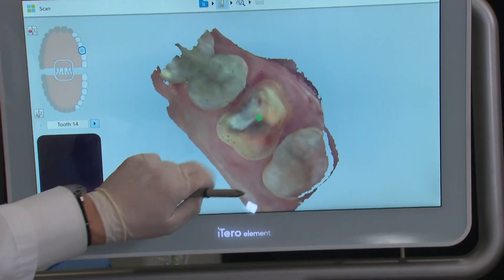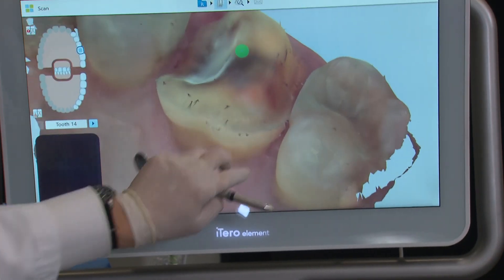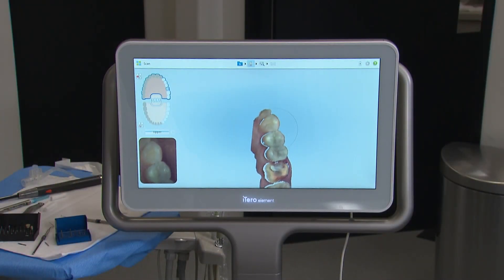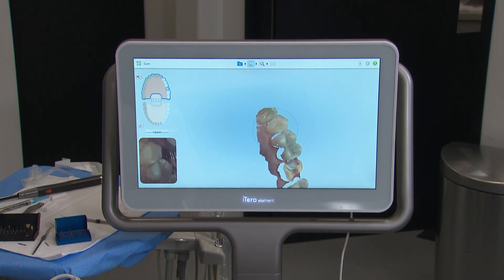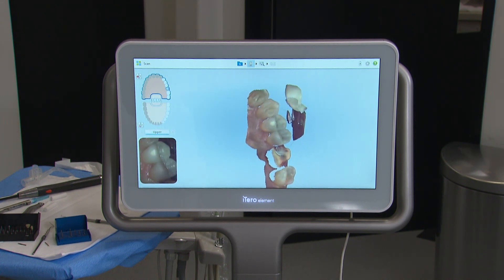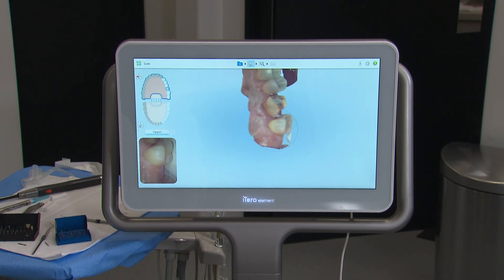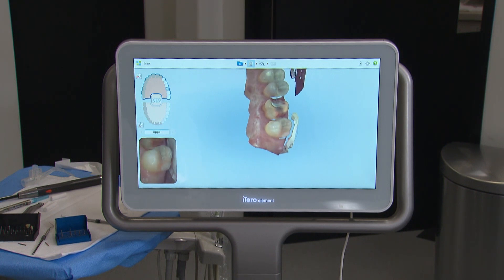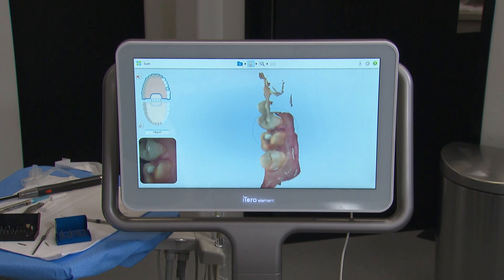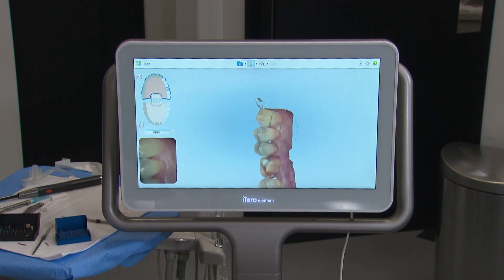As with any impression, drawing excess fluids from the teeth and gingiva will improve the accuracy of the impression. For the upper and lower quadrant scans, we start with the occlusal surfaces to lay the foundation of the digital model, then rotate the scanner and sweep along the lingual and buccal to add those surfaces and any undercut areas into the model. Since the system provides an immediate representation of the patient's dentition, we can assess our preps and tissue management to determine if any additional modifications are needed. It's also very easy to add any missing areas if we notice data missing from the model.